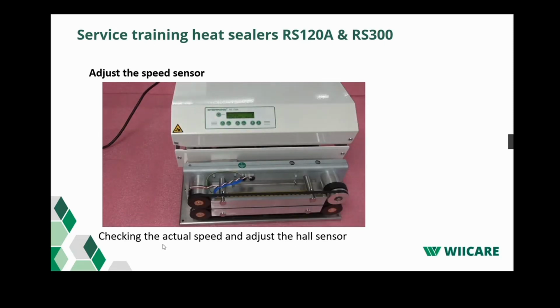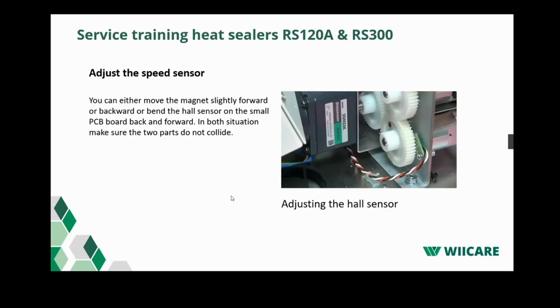You can start the sealer by holding something in front of the start sensor. Same one again. And here you can see how you can adjust the reading of the speed sensor slightly. You could move the magnet in the tooth wheel back and forward. It's a magnet where one side is red. And you could adjust it by slightly moving the hall sensor, which is on the little PCB board.